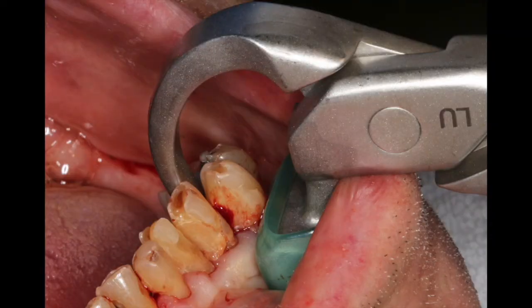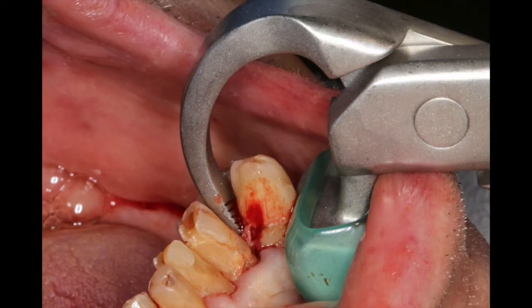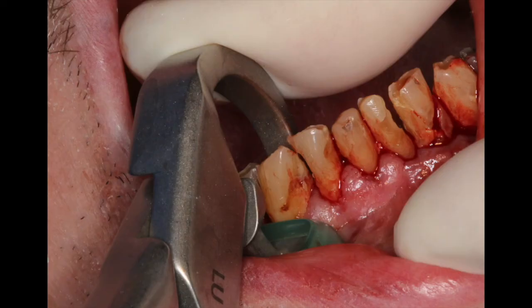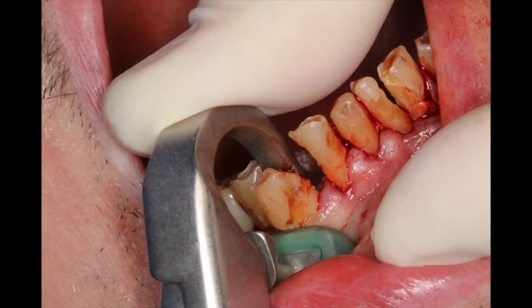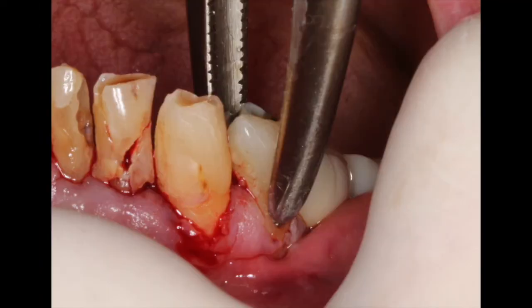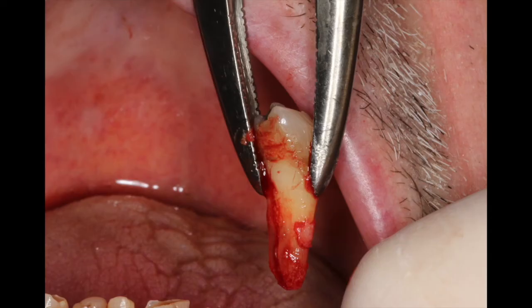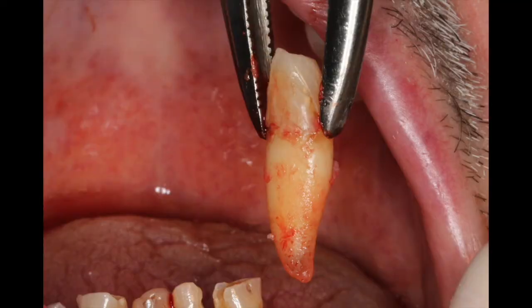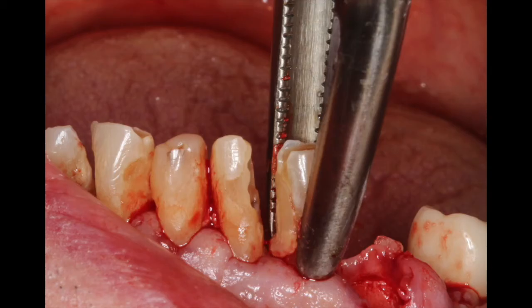The tooth will then luxate up and out of the socket, one to three millimeters, quite efficiently and effectively. This is what I refer to as an atraumatic extraction — atraumatic to the facial plate of bone, atraumatic to the patient because there's no squeezing, and also atraumatic to the doctor because it makes my procedure very predictable and effective. We'll then take a tooth delivery instrument and rotate the teeth up and out of the socket, maintaining the facial plate of bone wonderfully. Even a long cuspid tooth can be removed quite efficiently using this innovative technique of the Golden Dent physics forcep.